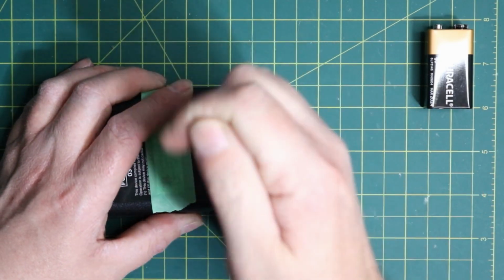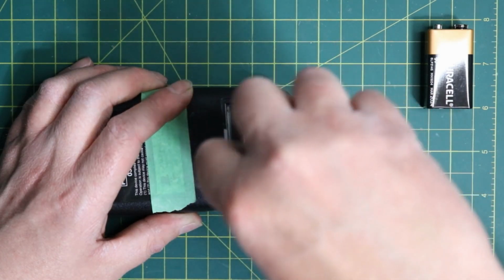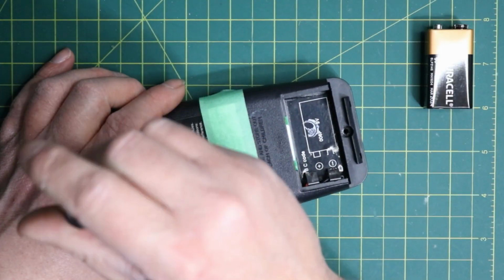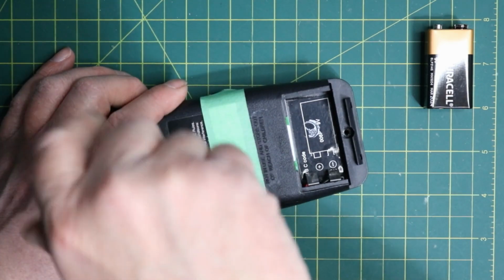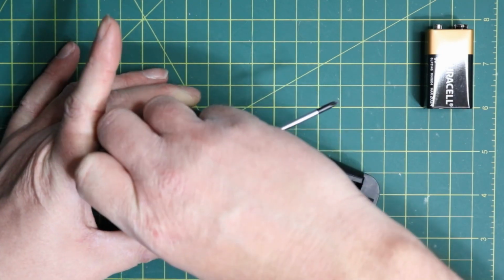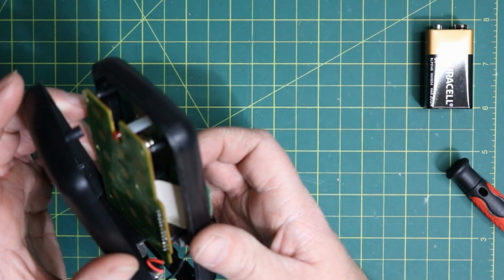Now there is two screws in the unit, one at the bottom under the battery cover as well as the one on the top. So like I said, this controller's come to me a few times in the past, and I've played around with it a little bit. I did notice the main board did have some wearing on it, so I tried to clean that up as much as I could, but we'll see what's going on the inside in just a moment, and see if we can't get this working once again.